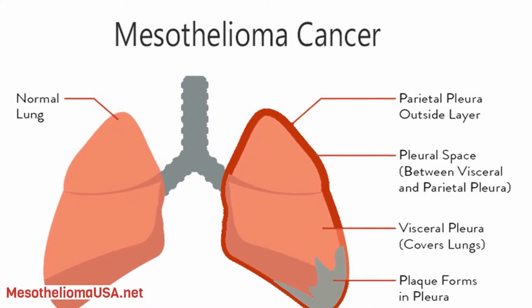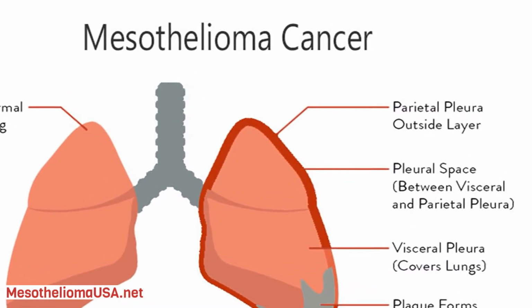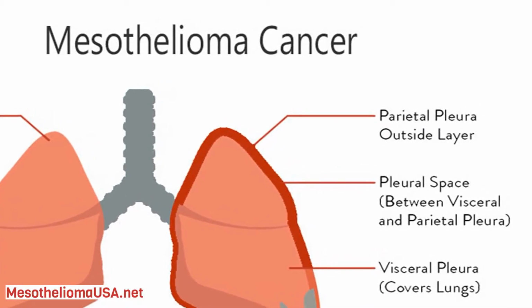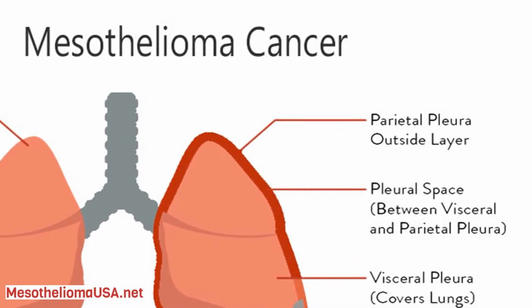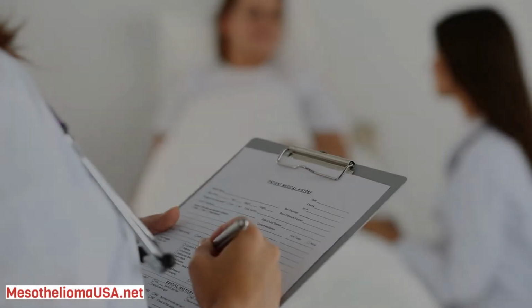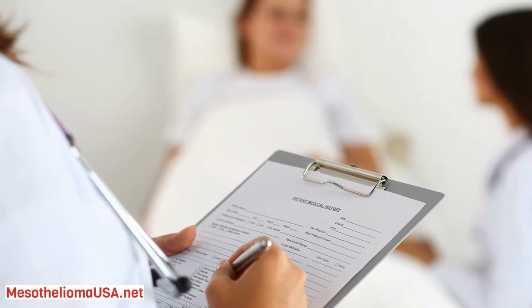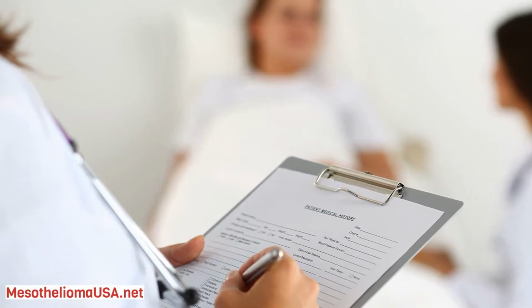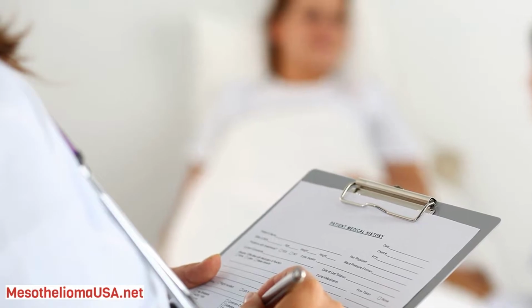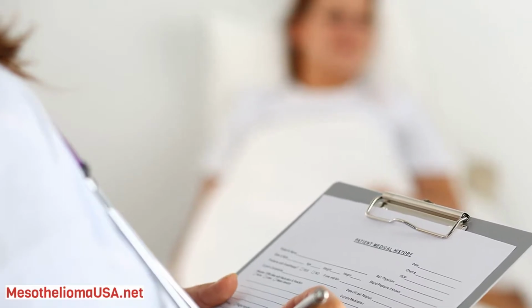Pathology and immunohistochemistry reports were considered as gold standard. The IHC panel of antibodies for differentiating malignant mesothelioma and metastatic carcinoma were HBME-1, WT1, D2-40, calretinin, CEA, MOC-31, and CK5/6. Chest CT scans were performed in all patients with and without contrast with a single detector CT scanner, Somatom Plus, Siemens, Germany. CT scans were observed by a chest radiologist, unaware of pathologic diagnosis.